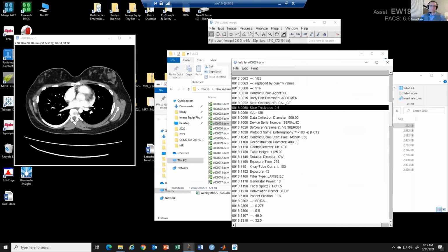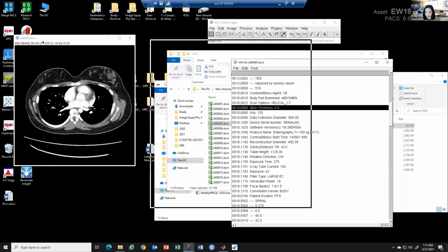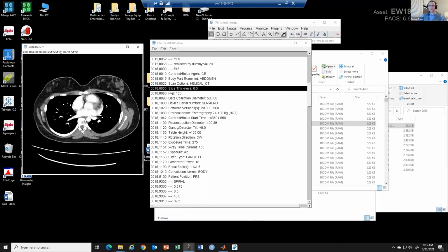I see. So I guess the noise index, you have like a standard number or like a table for the noise index for each scan or each organ, right? For each slice. So, well, okay. If you have, for example, this patient you see right here, I would have set up an SD of, I don't even know how big this patient is. This patient probably had an SD value of 12.5. I'm just guessing based on their size. In other words, every slice would be 12.5.